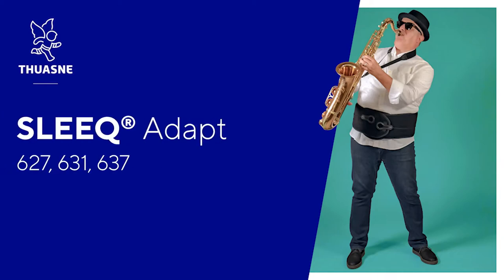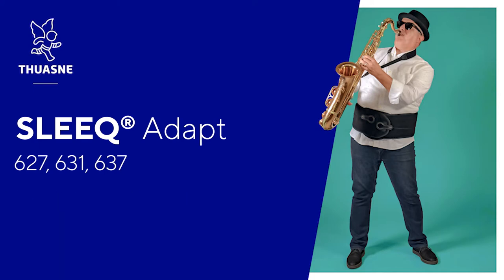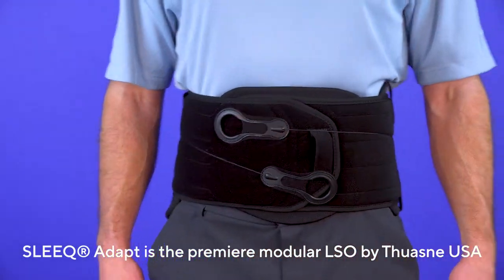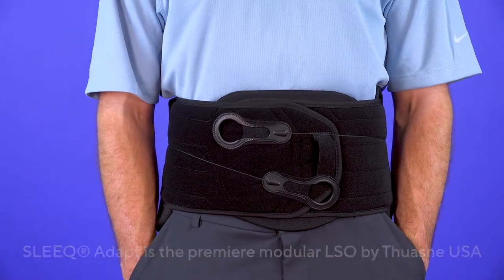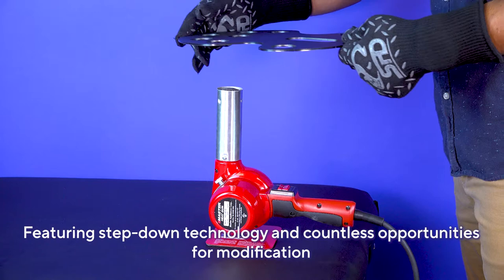The SLEEQ Adapt by Thuasne USA Fitting and Modification Guide. The SLEEQ Adapt is the premier modular LSO by Thuasne USA, featuring step-down technology and countless opportunities for modification.